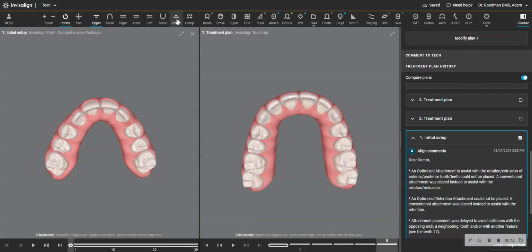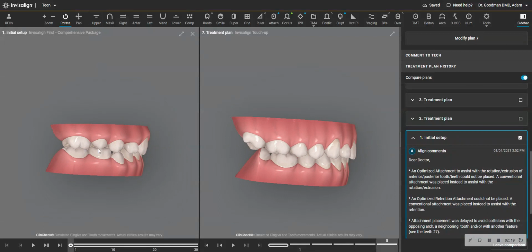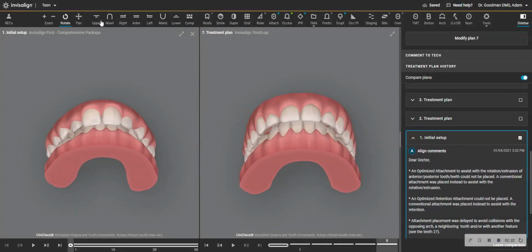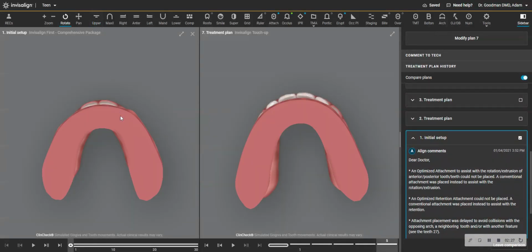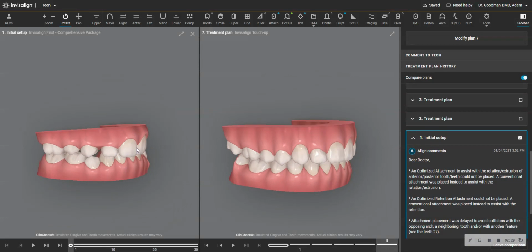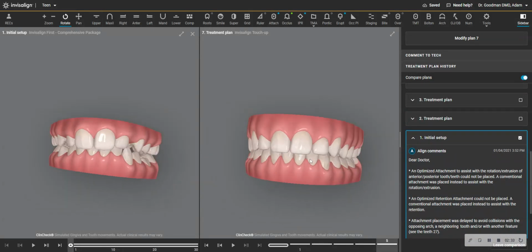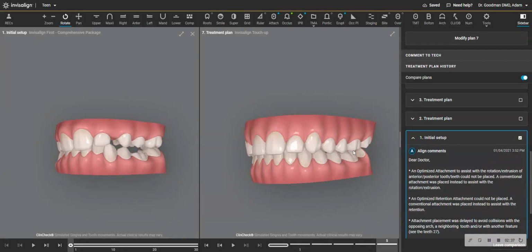And then the other appliance that is used: I think this patient had been told they needed some sort of night brace to push the molars back. But what I did is I expanded the upper arch, the dental expansion. Then that created overjet, and the patient wore elastics to bring the lower jaw forward into the perfect class 1 that you see over here. So this is what gives you a full face.